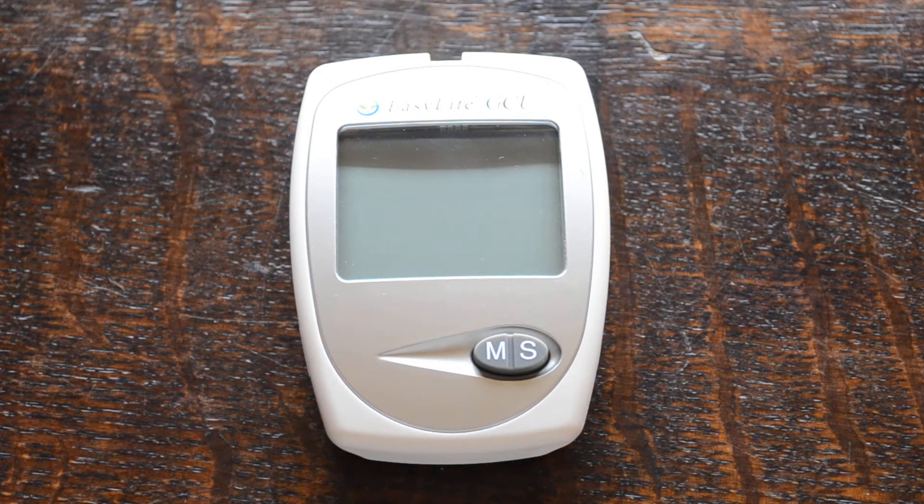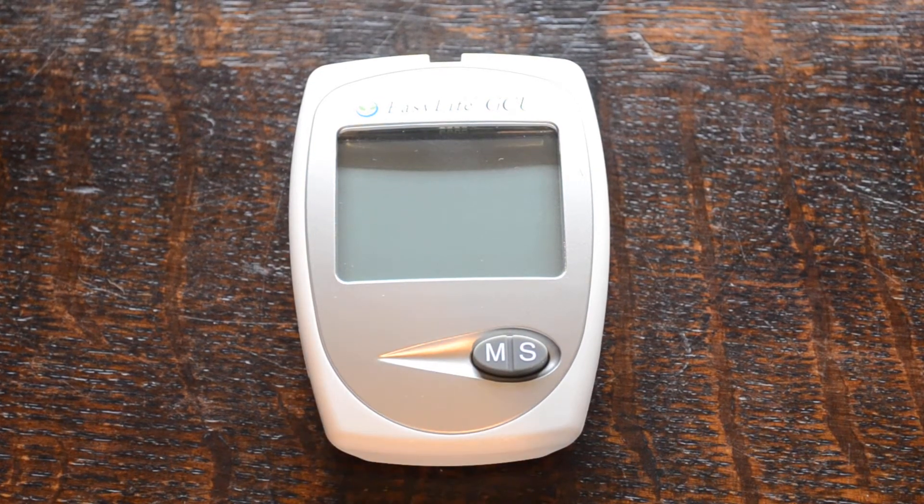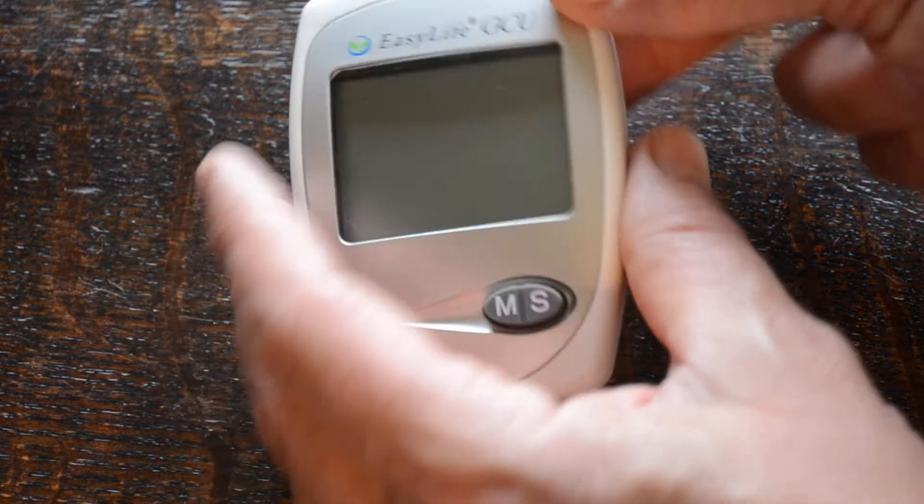Welcome to this video where we're going to show you how to set the time and date on an Easy Life glucose, cholesterol, and uric acid meter. This is the basic meter system that you get when you buy the triple meter.